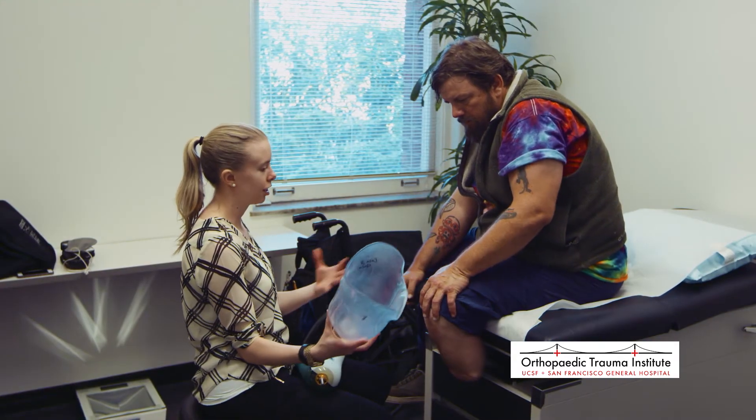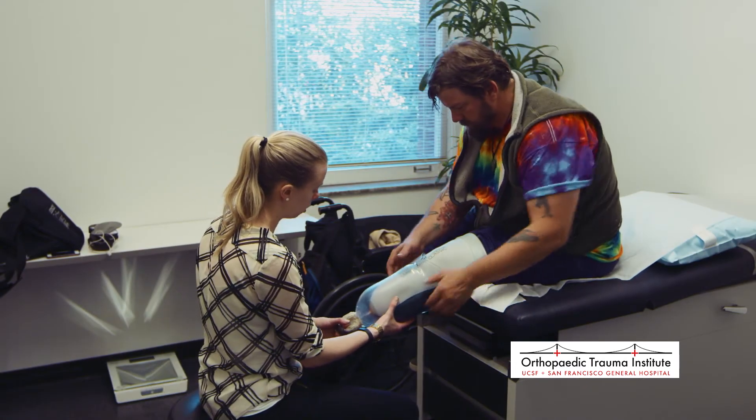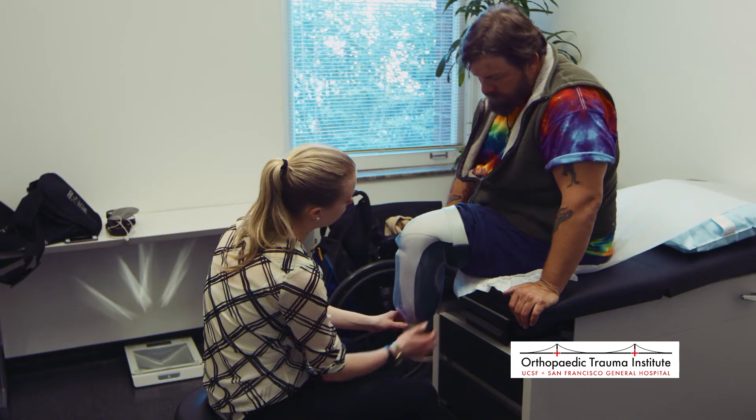Here, Hannah is fitting Don with his initial test socket. During this process, she will try to determine how Don's residual limb fits within the socket and whether there are any points of pain or discomfort that need to be accounted for in the final socket.